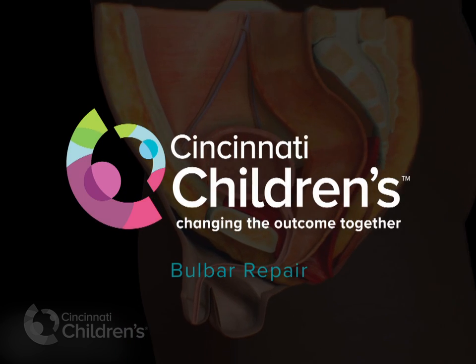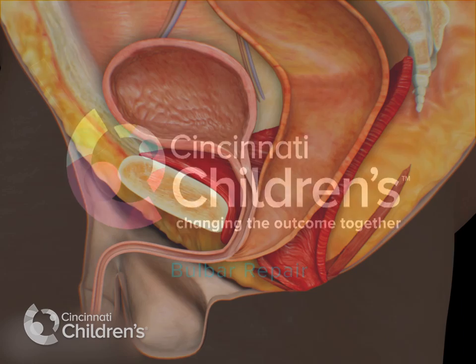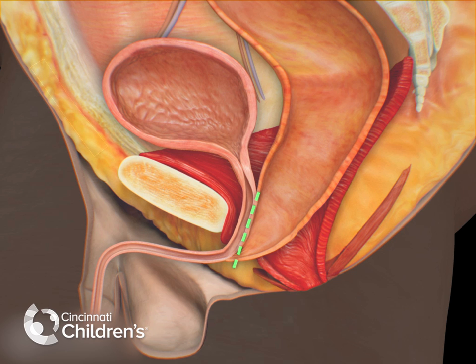You are looking at the side view of the pelvis of a baby with anorectal malformation that we call rectal urethral bulbar fistula. The main and most important part of the operation is to separate the rectum from the posterior urethra, making two walls out of one.